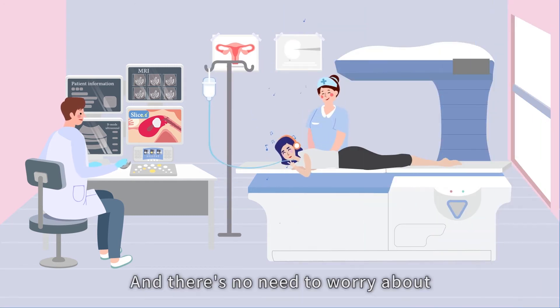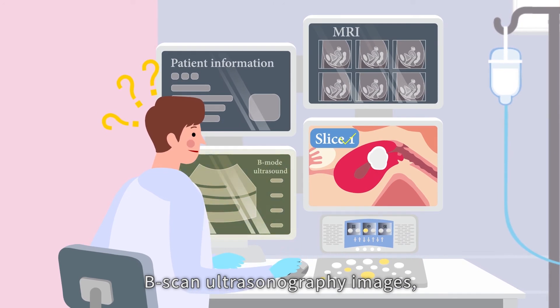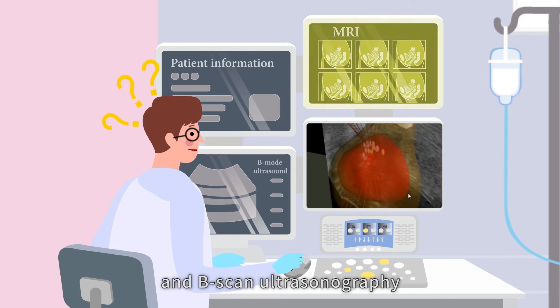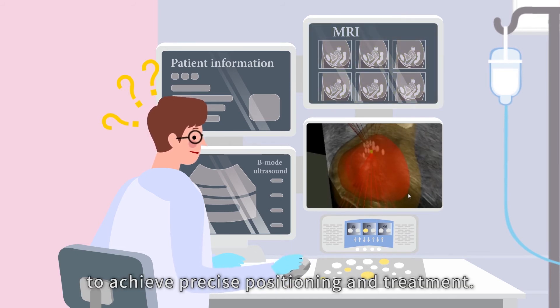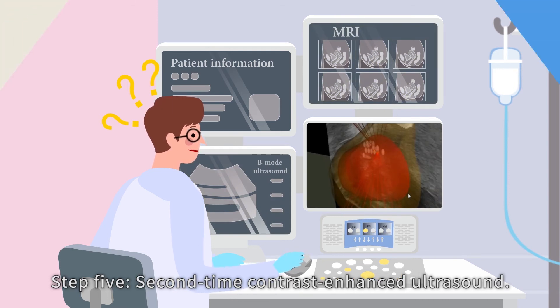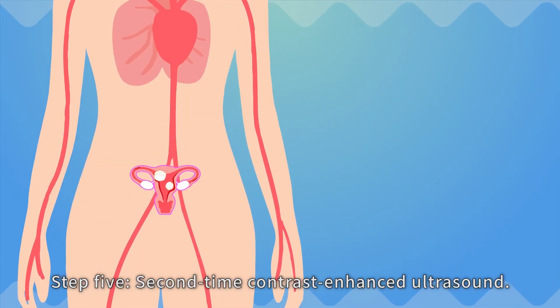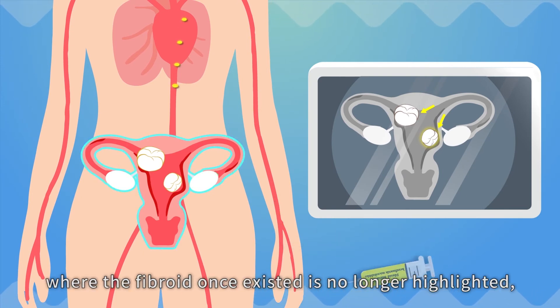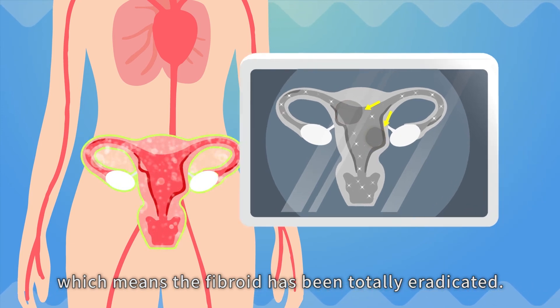There's no need to worry about imaging, because our product is equipped with both 3D magnetic resonance imaging and B-scan ultrasonography to achieve precise positioning and treatment. Step five: second contrast-enhanced ultrasound. Apply the contrast agents once again and we will find that the place where the fibroid once existed is no longer highlighted, which means the fibroid has been totally eradicated.